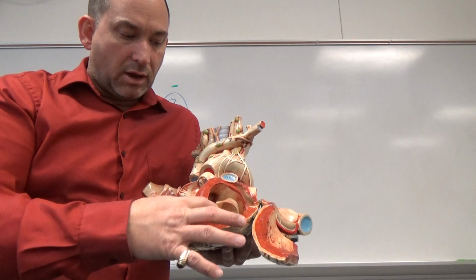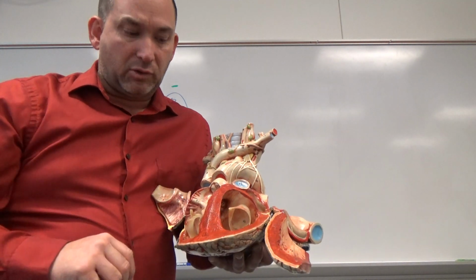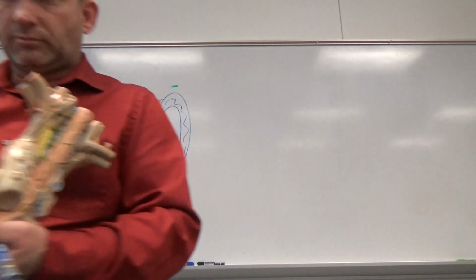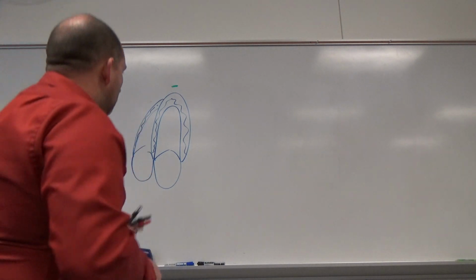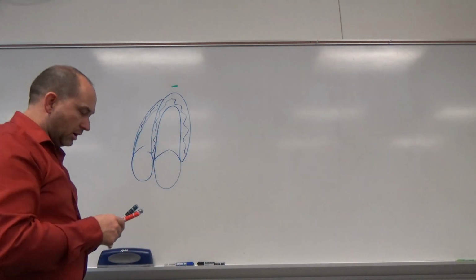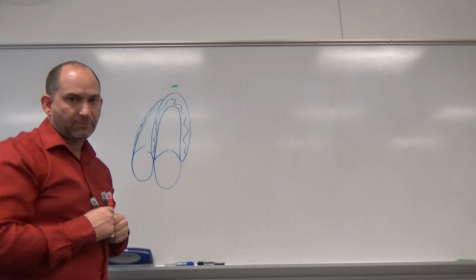We only see the tricuspid and mitral valves at the posterior aspect of that, lots of trabeculations near the back, etc. So we're really looking at the posterior aspect of the LV when we're looking at four chamber view.